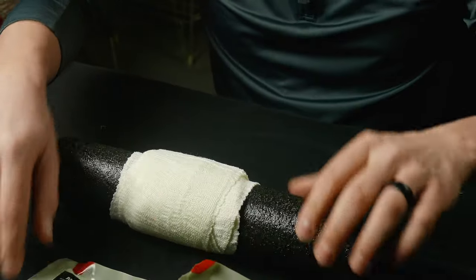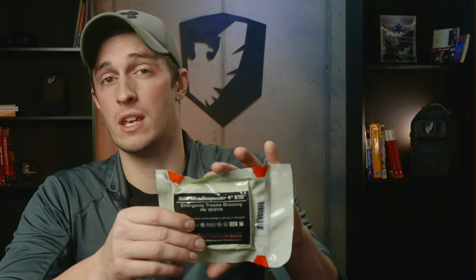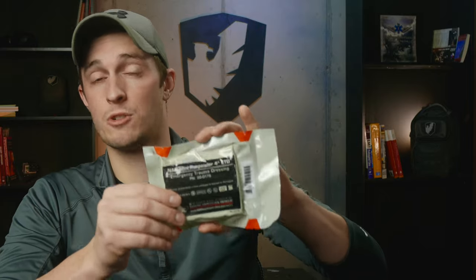That is a quick overview of the North American Rescue Mini Responder 4-inch ETD. You can buy this on our website at sixecosystems.com.